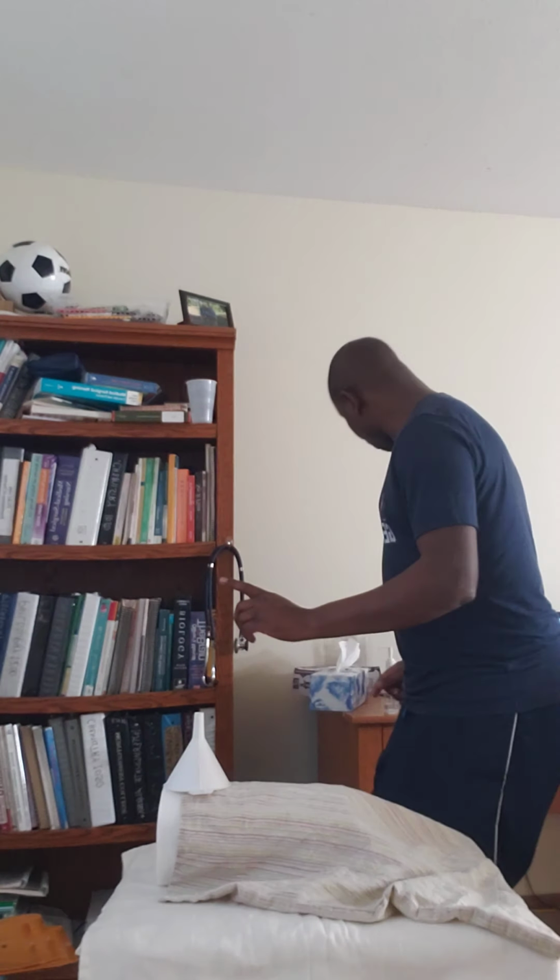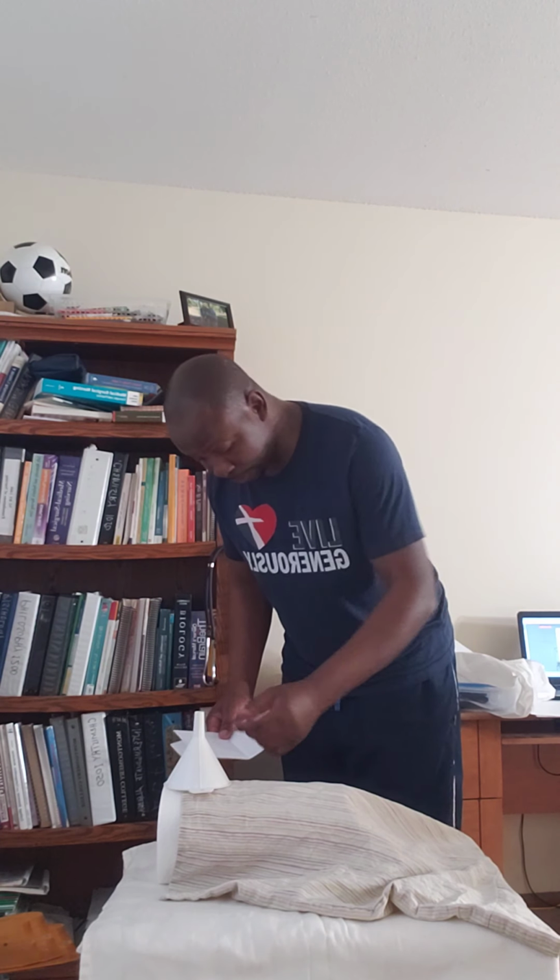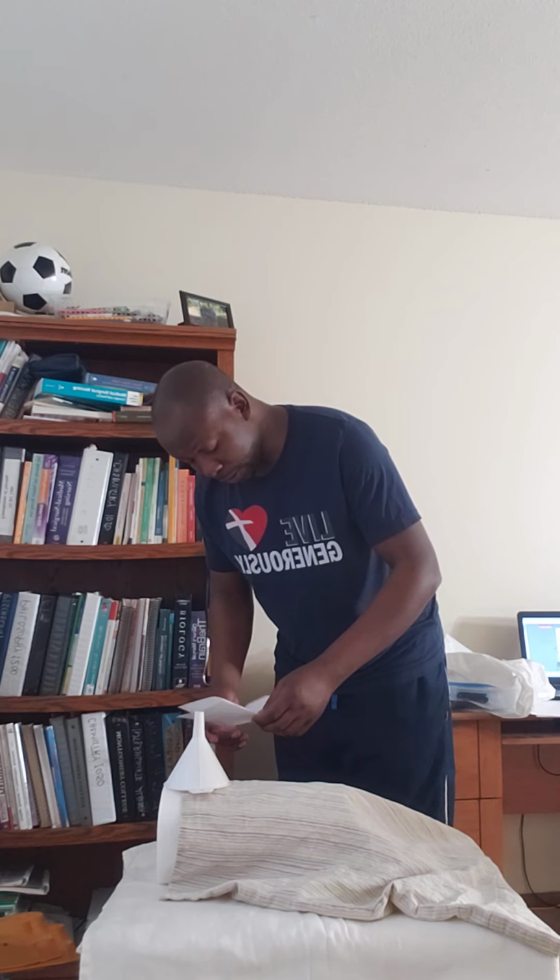Okay, so what is your name? My name is Mr. Dwayne. Since I'm doing this, I'm going to have my order with me, because I have to make sure the patient is telling me the right name. So what's your name? My name is Dwayne. What is your birth date? My birth date is April 28th, 1956. Okay, so now I'm finished. Then I explain the procedure, that I'm here today to perform tracheostomy care.